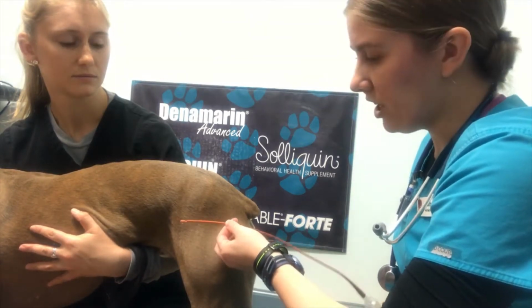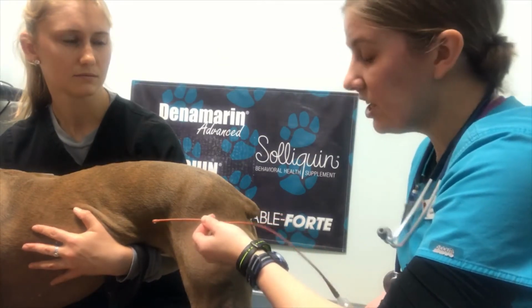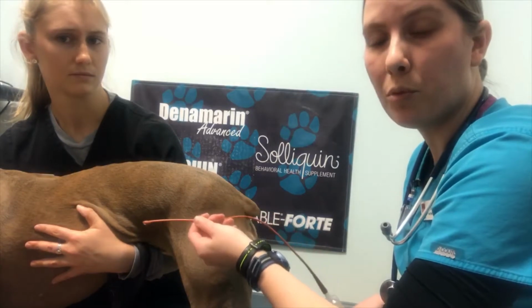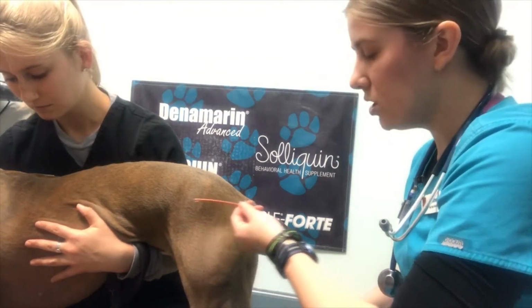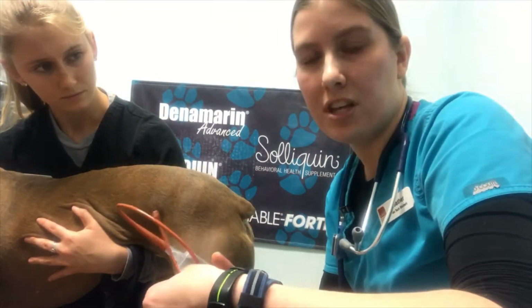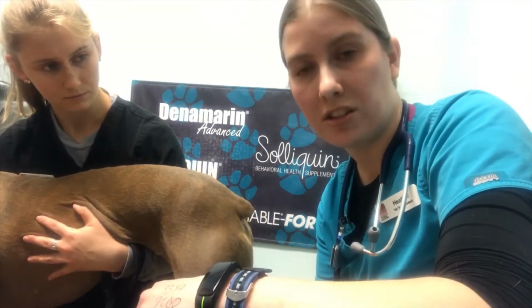As you do so, you want to be able to hopefully work it up a little farther, so you can maybe get it past the blockage, the area of constipation, so you can break it up more easily. Once you have fully administered the enema solution, you would pull out and then get the patient situated, and hopefully they would then produce stool and be rid of the constipation.